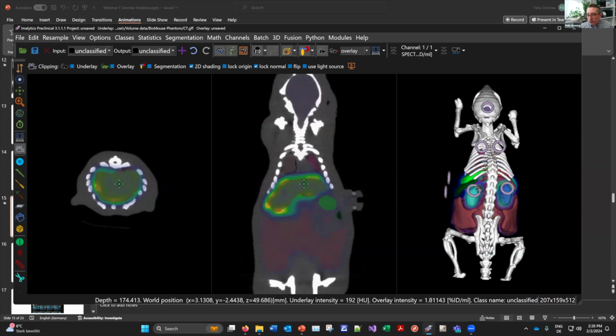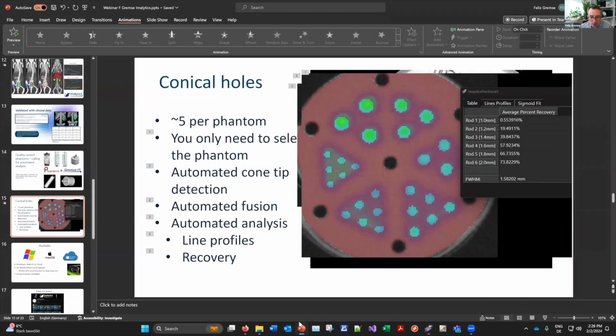And this, as I mentioned, is quite important for your quality control, or quite useful to be able to check if everything is working properly, like your scanner, your image data, but also your software analysis, to validate that your whole processing actually makes sense. It's much easier to check it in a phantom than in a mouse, actually.